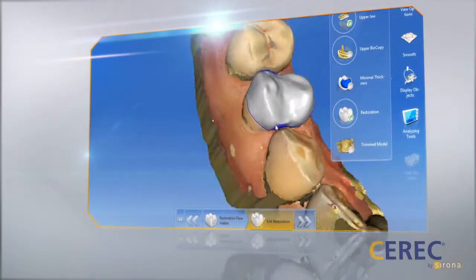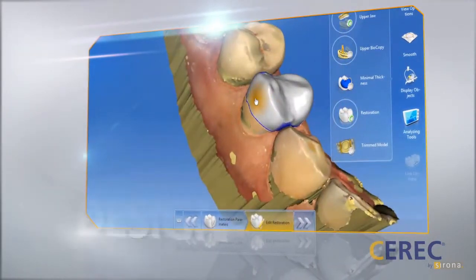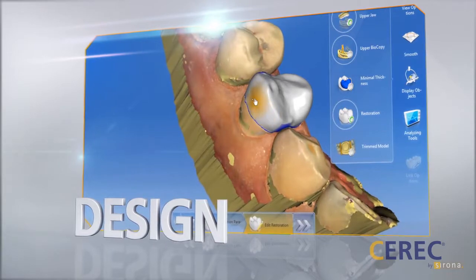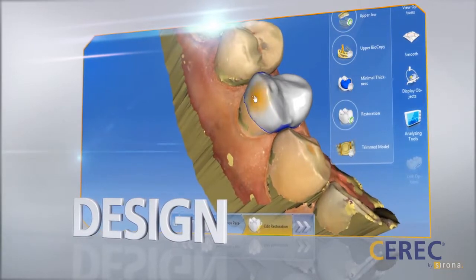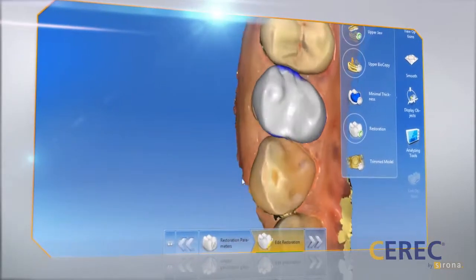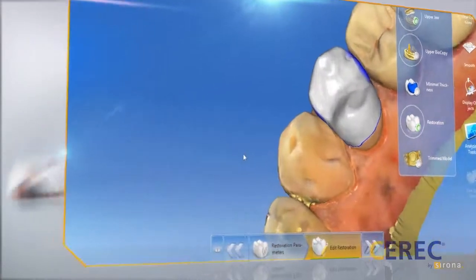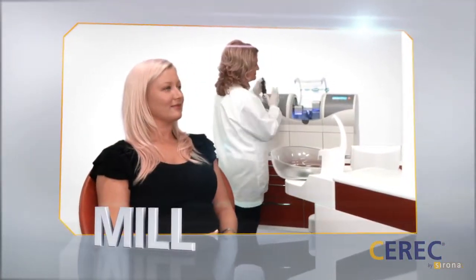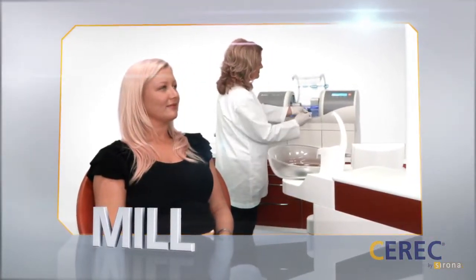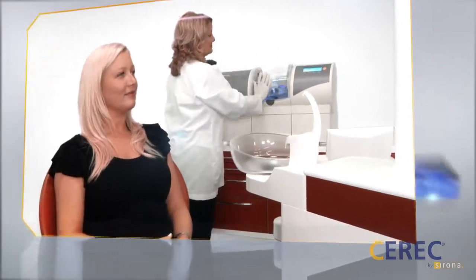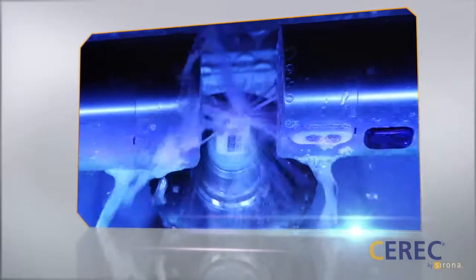The CEREC software allows the dentist to design a restoration quickly and easily without compromising precision and beauty. After the design, the dentist simply fabricates the restoration using a ceramic block in a CEREC milling unit.